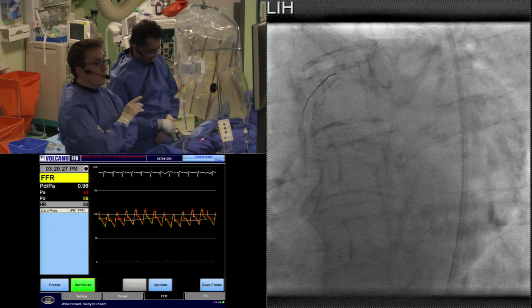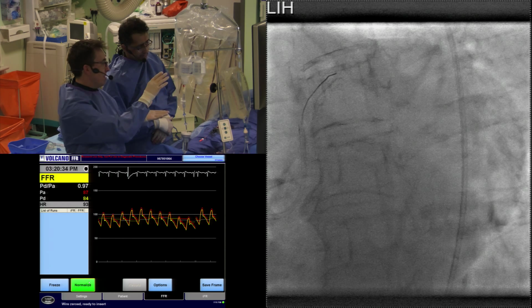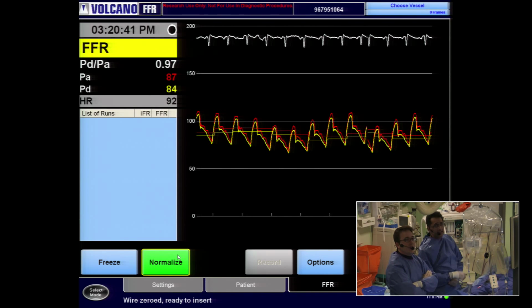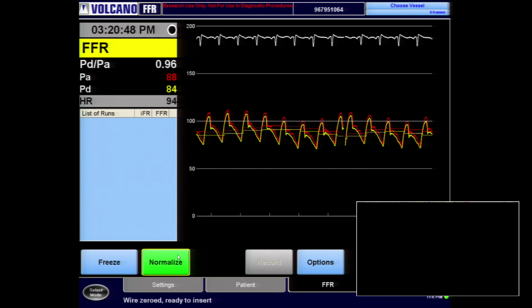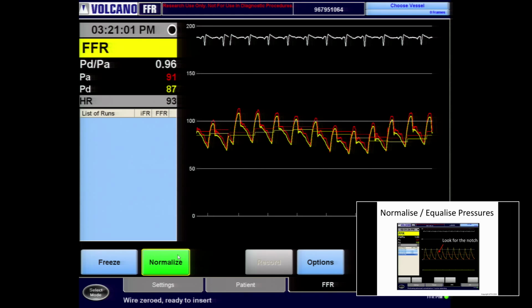Can I ask you, before we make a normalization here, do you think there's any chance that, due to the angle of the guide catheter, we could be damping the aortic signal a little bit? Okay, I think that's a very good point, because what we can see is a great dicrotic notch, and I think the dicrotic notch is a great marker that we probably haven't got very much pressure damping. It's a rather short left main stem, so manipulating the guide catheter to try and get it to align is going to be slightly challenging, and it may fall out altogether. We considered whether an EBU4, this is an EBU 3.5, would be any better, but I suspect it would have the same sort of problem. It's just that the main stem's very short.